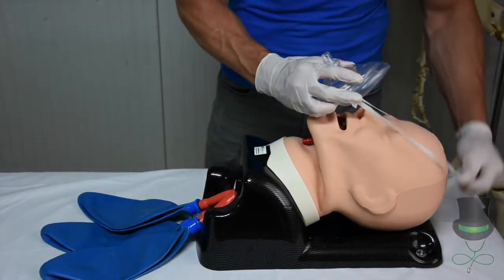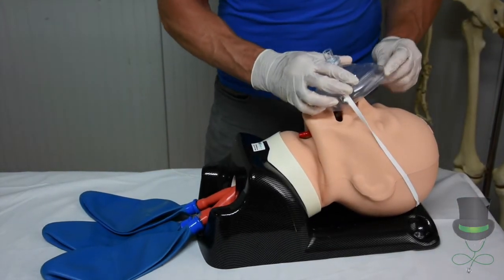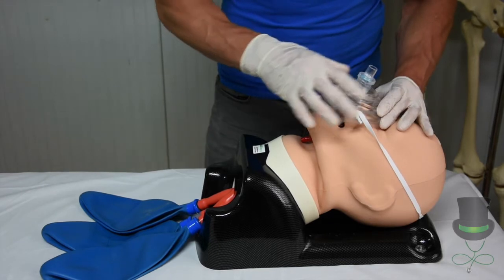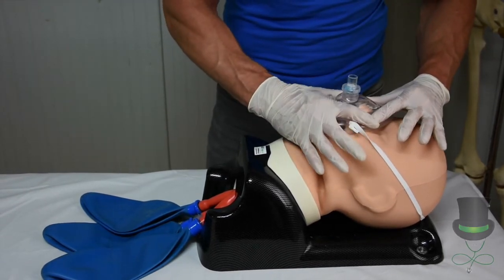Next, place the mask over the patient's head. Bring the apex of the mask onto the bridge of the patient's nose, putting downward pressure onto the patient's chin with a C and E grip.